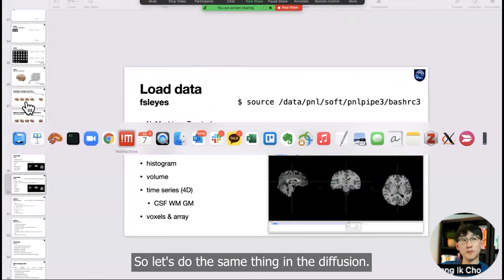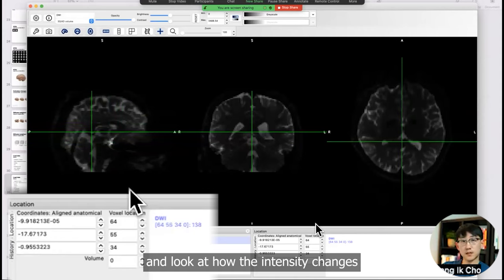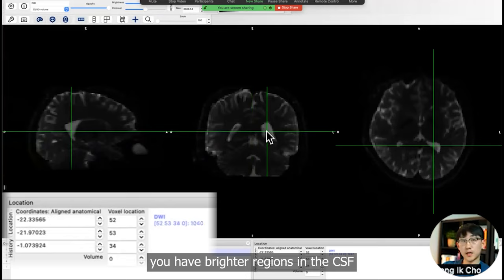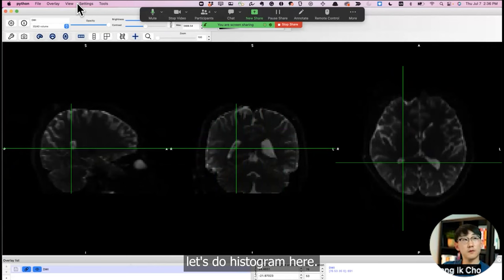Let's do the same thing in the diffusion. This is the diffusion map opened in FSLeyes. It's a little darker here, so you can go around that and look at how the intensity changes. Since this is an EPI map, you have brighter regions in the CSF, darker in other tissue. In the sulcus and gyrus, you can see CSF infusing here.